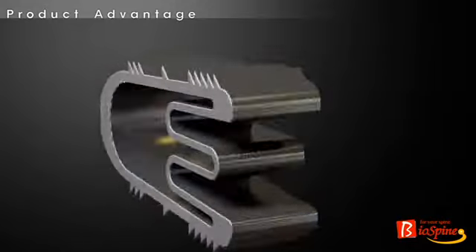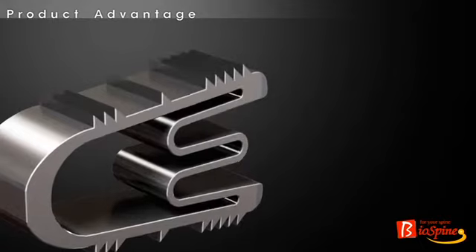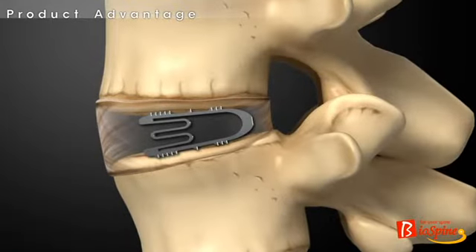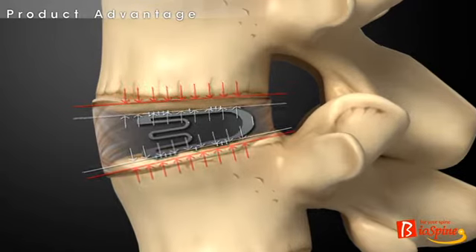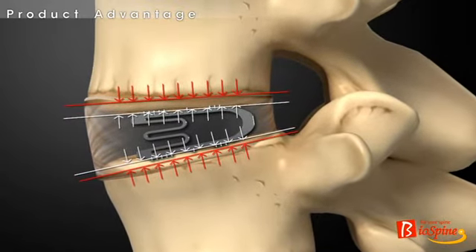That is, thanks to the superelasticity of nitinol and the shock absorption effect of the plate spring, the flexible cage system can minimize the reaction force applied to the end plate of the vertebral body, which originates from the axial compression load applied to the cage.